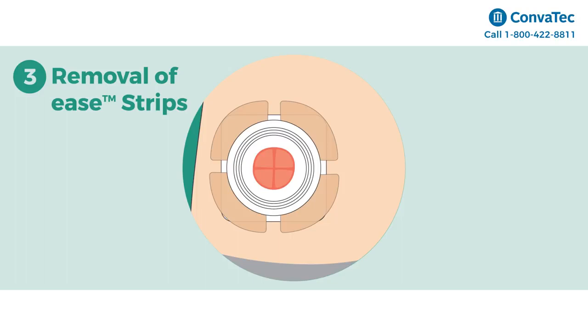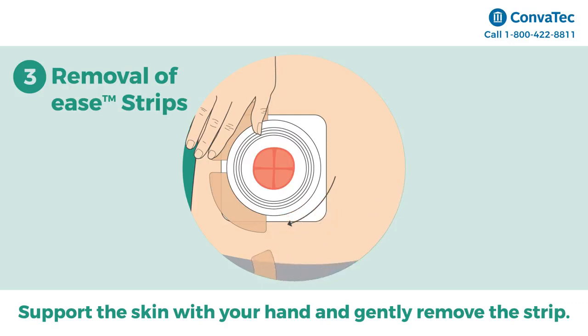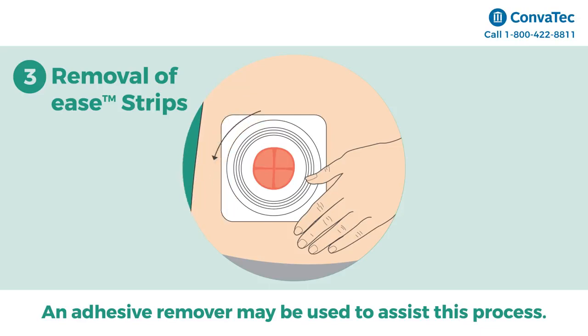Step 3: Removal of Ease Strips. Support the skin with your hand and gently remove the strip with your other hand by continuously peeling horizontally until fully removed from the skin. An adhesive remover may be used to assist in this process.